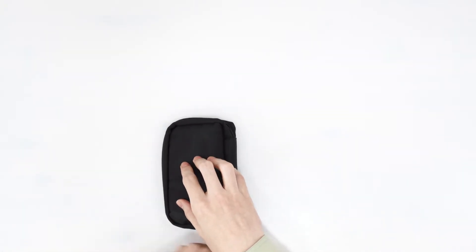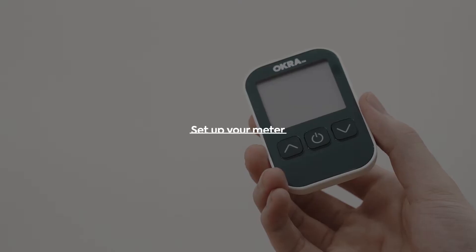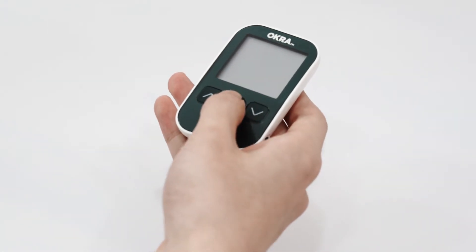Your kit contains everything you need to quickly begin using your meter. Let's get started. Use the up and down buttons to change your settings and press the power button to save. With the meter off, press and hold the power button.